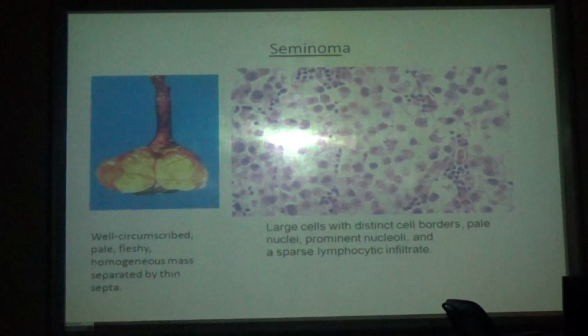This is the thin septa here. If I show you only this picture, you can pick it up as seminoma. This is very classical.